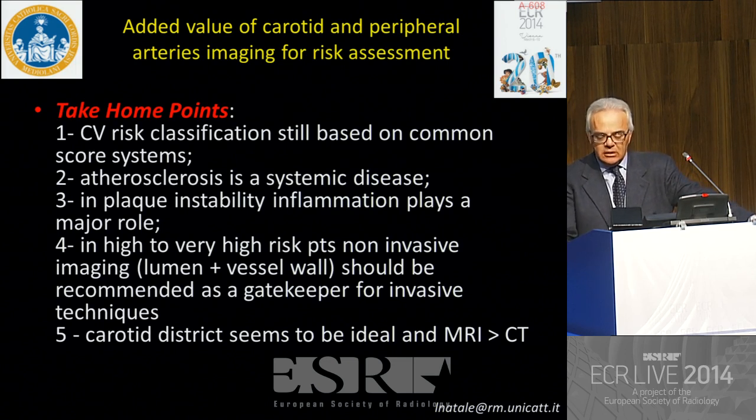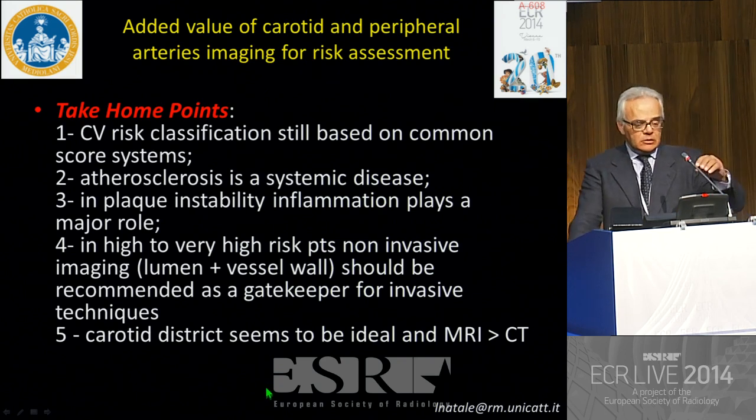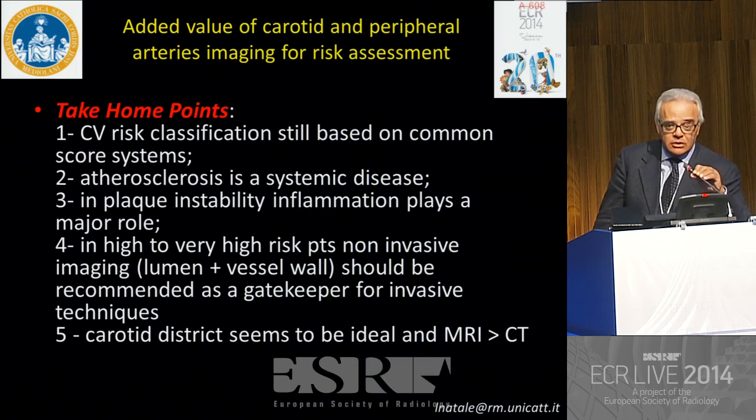Maybe in the future it will be easier to study the coronary plaques, but at the moment it's not the case. And for the carotid district, there is no doubt that MRI can give us more and more information over CT. With this, I finish, and thank you very much for your attention.